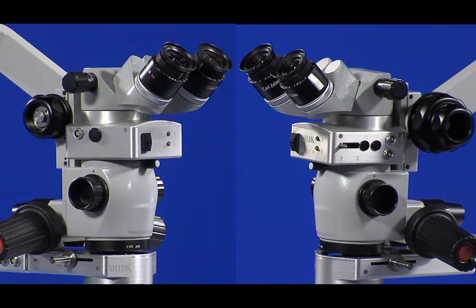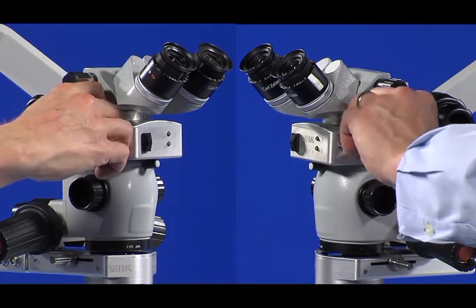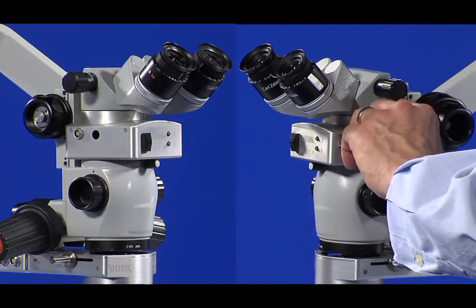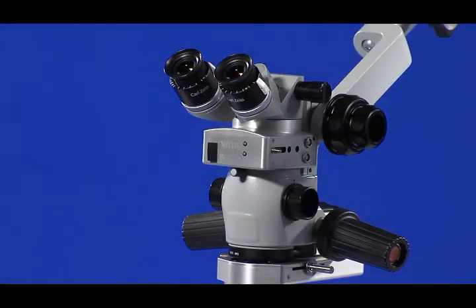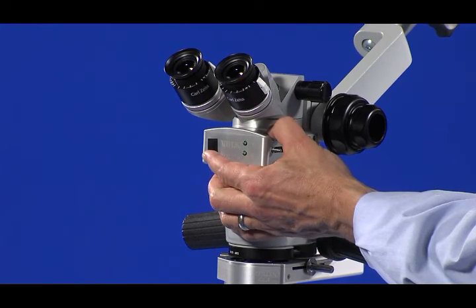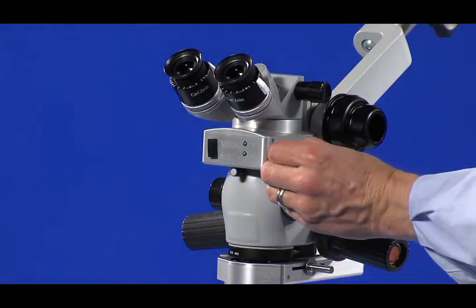The first step in adjusting the prism of the Rolls Infinity reinverter is to remove the black access hole covers. These covers are snap-fit into place and may be removed simply by prying them out. If you have the automated Rolls Infinity model, you must switch it to manual operation mode in order to make adjustments to the prism. Then manually move the prism to its rear location.